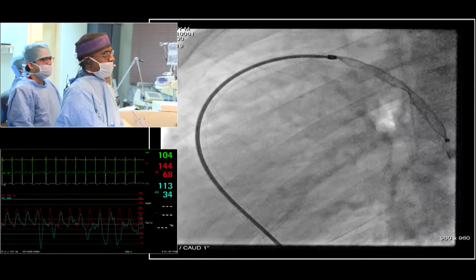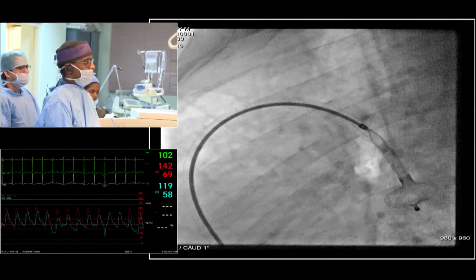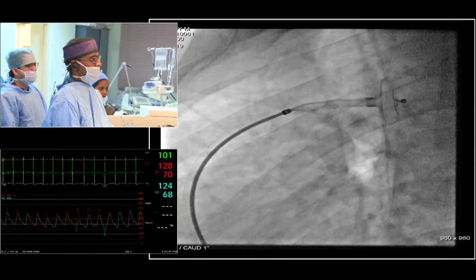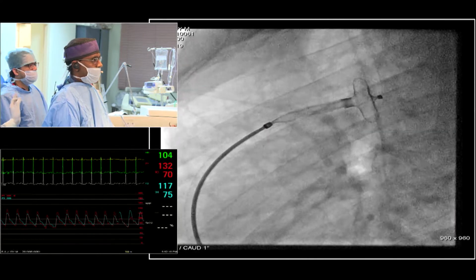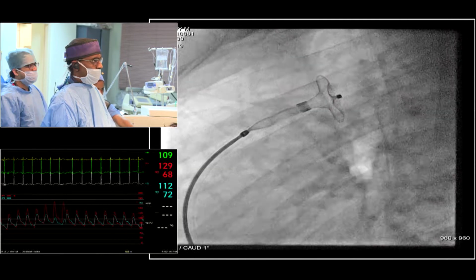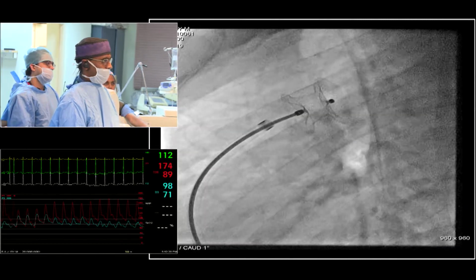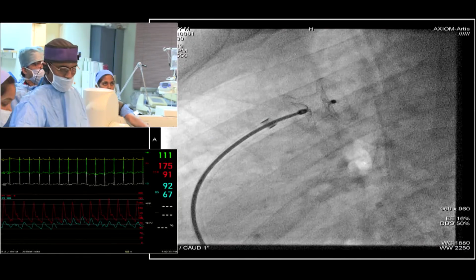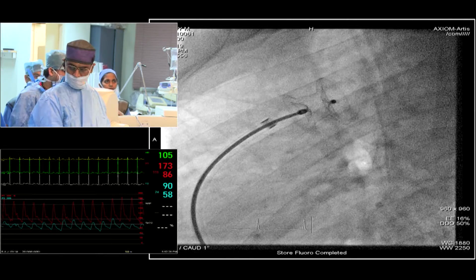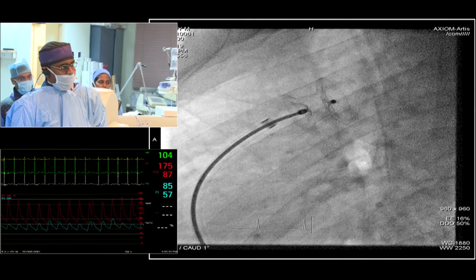There's no penetration. What do you think? The hemodynamics suggest that it's not necessary to have a Potts shunt and the physiology later on. I think this is a good idea to use this device. In addition, I have only done it once with an Amplatzer muscular VSD device, but this seems better. If you need it later on, maybe the patient will develop suprasystemic pressure in 5-6 years or whatever in follow-up, then you can perforate this device again and make it a Potts shunt. That I want to consider in addition.